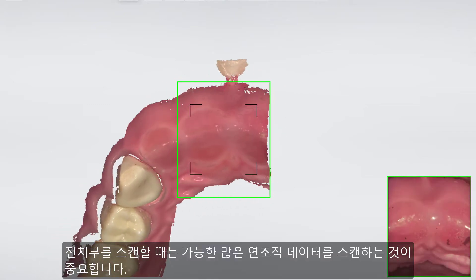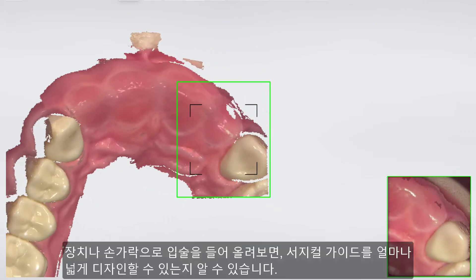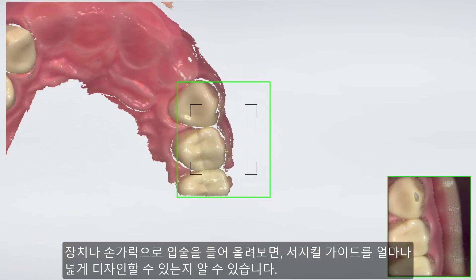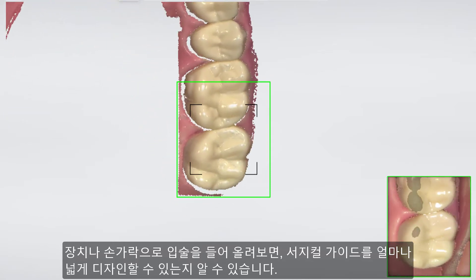When scanning the front teeth, it is very important to retrieve as much soft tissue as possible. Lift the lip with an instrument or fingers to add tension to the soft tissue, so later we will know how far we can extend the guide.